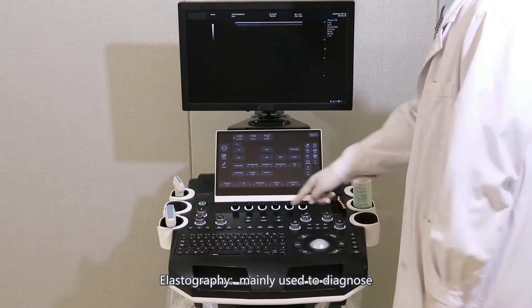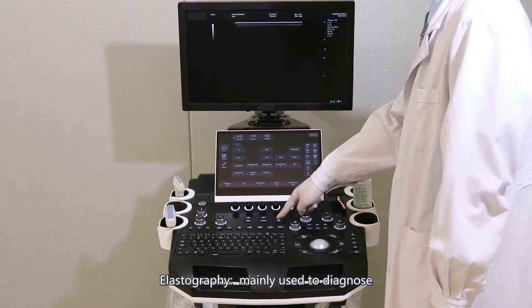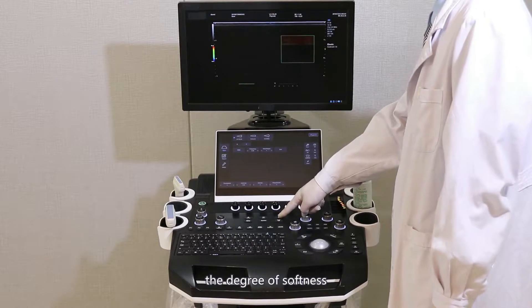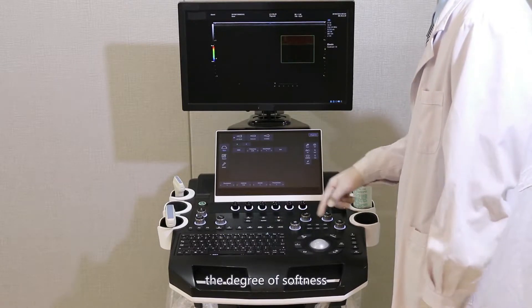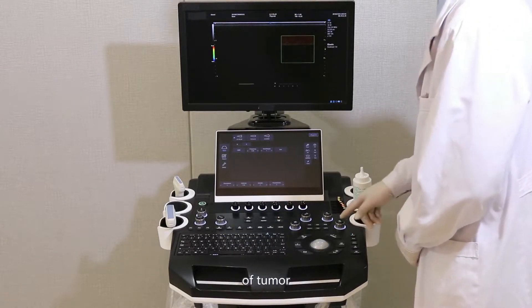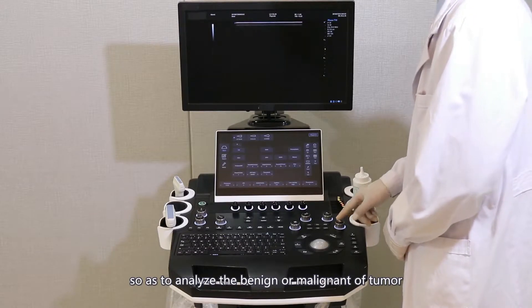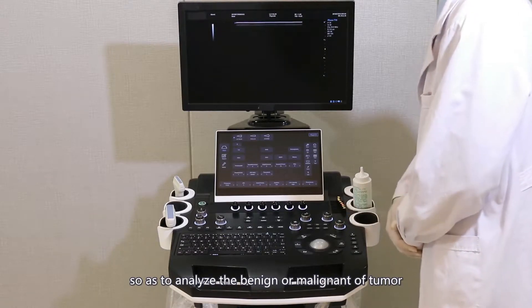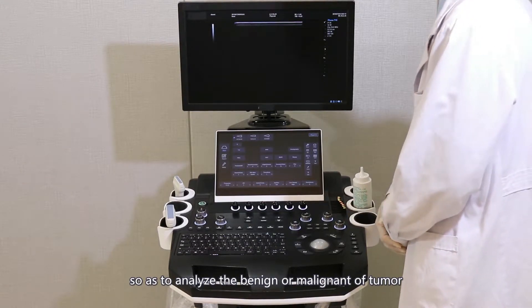Elastography: mainly used to diagnose the degree of softness and hardness of a tumor, so as to analyze whether the tumor is benign or malignant.